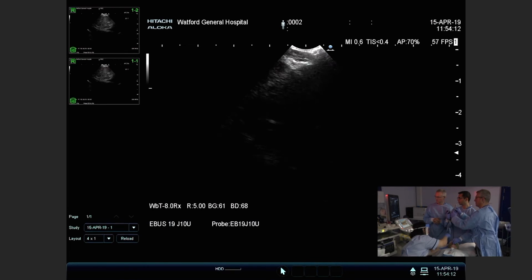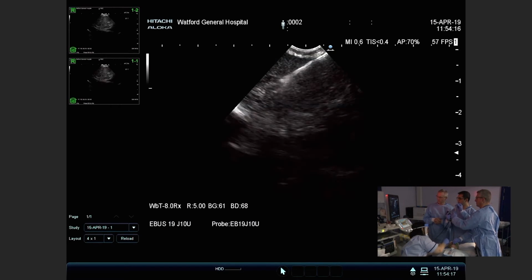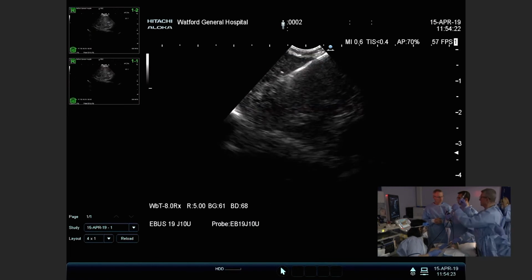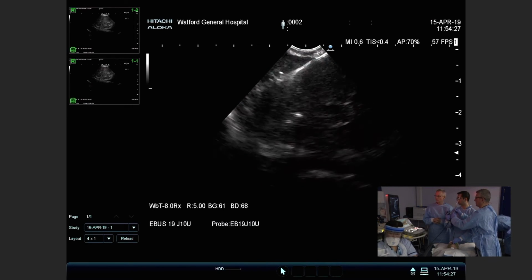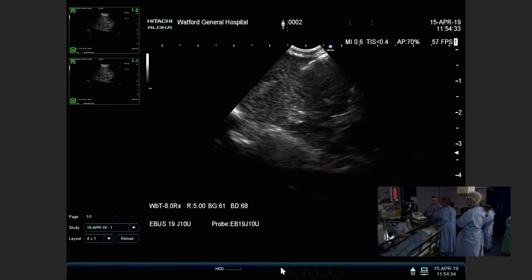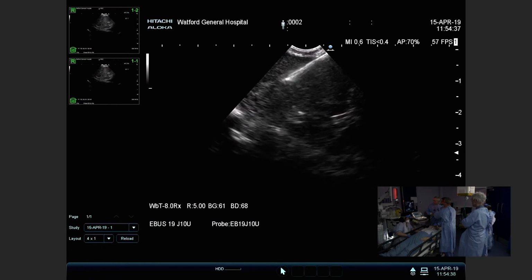Go for it. Okay, so sorry, I'll quickly finish with the sixth landmark now. So you come back in the trachea, one to two cartilage interspaces above the carina at the 1 o'clock position, which is sort of you rotate 70 degrees or so clockwise, and that is where the 4R is. So that second pass into 7, that's very good material. Excellent. So not necrotic. Okay, that's good.